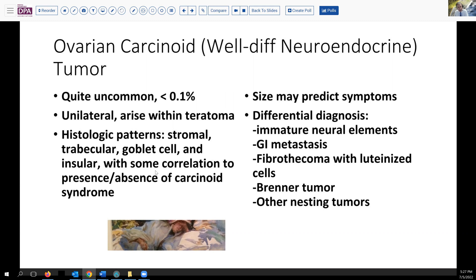These patterns tend to correlate to some degree with the presence or absence of carcinoid syndrome. The trend in the field is to get away from pure histologic descriptions and speak more about better predictors for behavior. The differential diagnosis includes, as illustrated, immature neural elements, but also metastatic disease from a gastrointestinal source, and occasionally other primary tumors of the ovary. Usually you would not be considering these in the presence of an associated teratoma — they would primarily be in the setting of a pure carcinoid tumor without evidence of a mixed germ layer tumor.